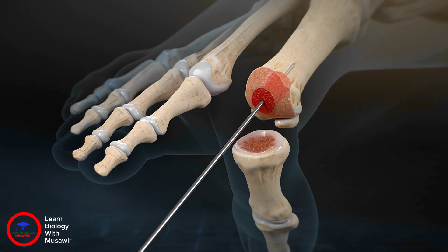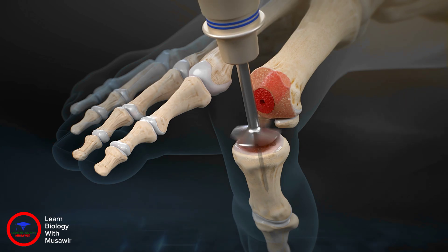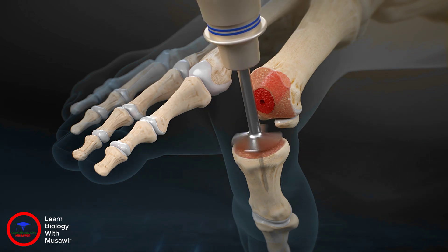It is important to remove all the original native cartilage from the metatarsal head as standard when preparing a joint for fusion. Insert a 1.6 millimeter guide wire into the proximal phalanx and use the phalangeal reamer to prepare the base of the phalanx.